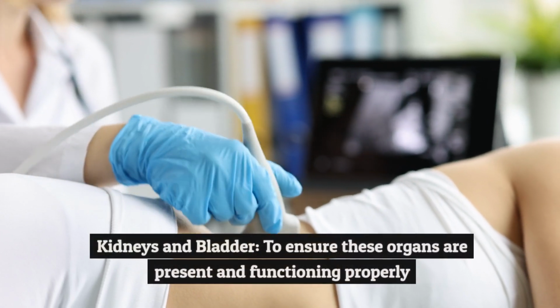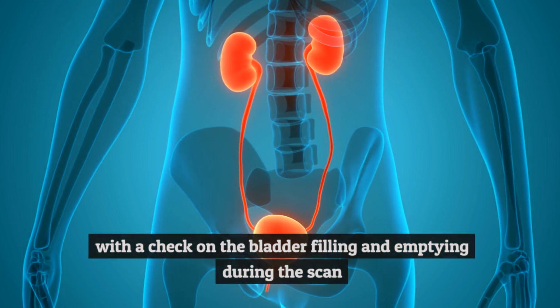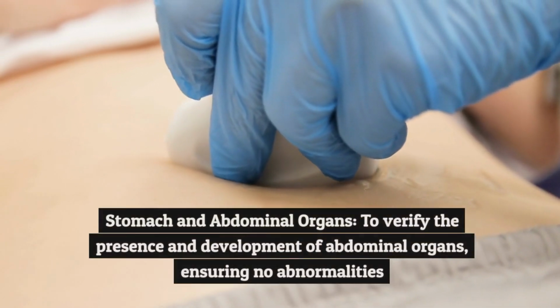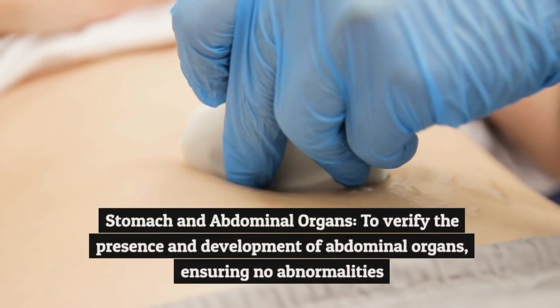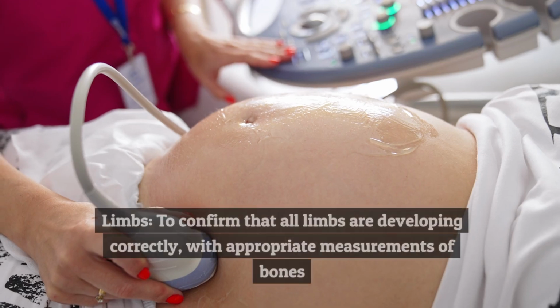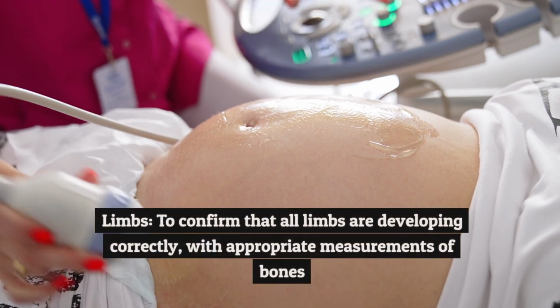Kidneys and bladder, to ensure these organs are present and functioning properly, with a check on the bladder filling and emptying during the scan. Stomach and abdominal organs, to verify the presence and development of abdominal organs, ensuring no abnormalities. Limbs, to confirm that all limbs are developing correctly, with appropriate measurements of bones.